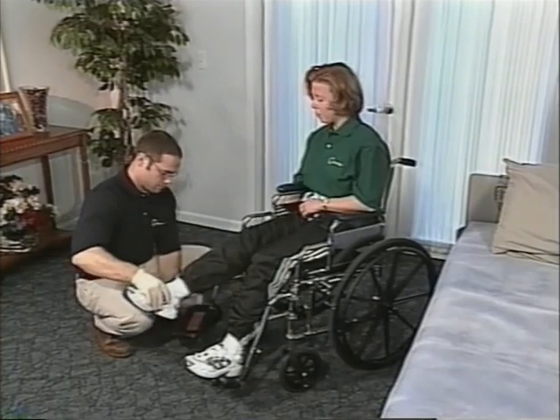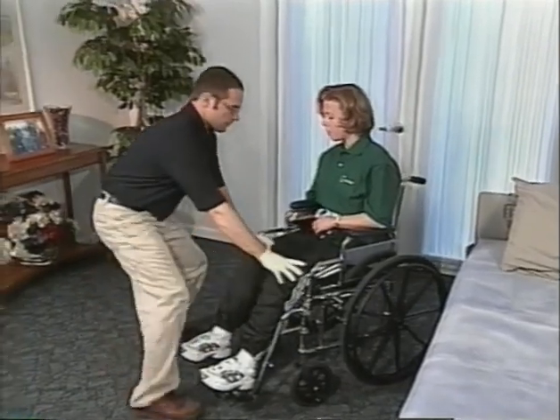Apply any necessary bracing. Take 2 steps back and observe the client in their wheelchair, looking for any asymmetries, especially in the hips, and be sure that the client looks comfortable.